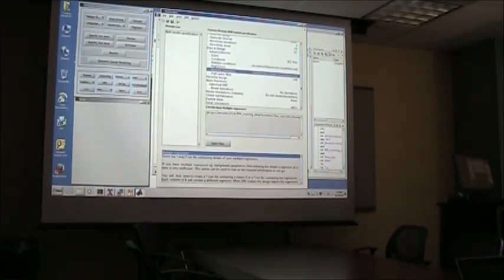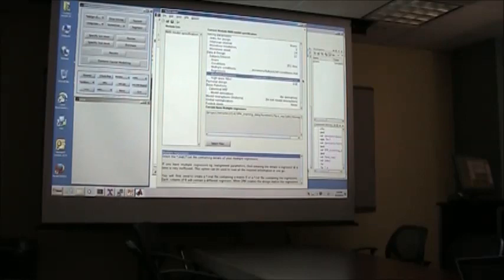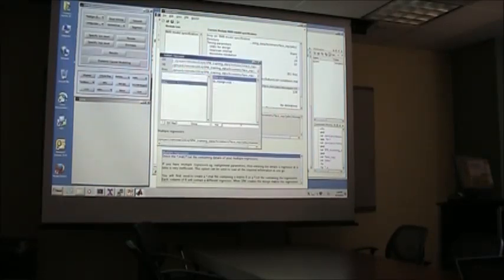I didn't see that. I couldn't find it. Where does it go? The text file. So the text file actually, it's in the manual. You have to replace it, move it and rename it. Okay. Usually it's... Didn't see it anywhere. It should be in your processed data.